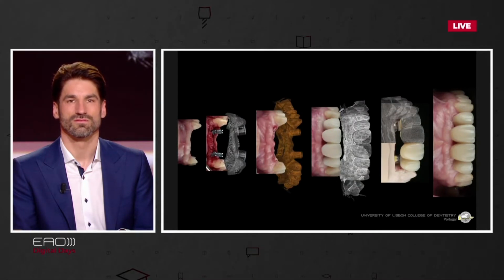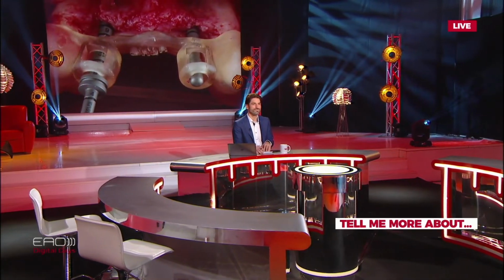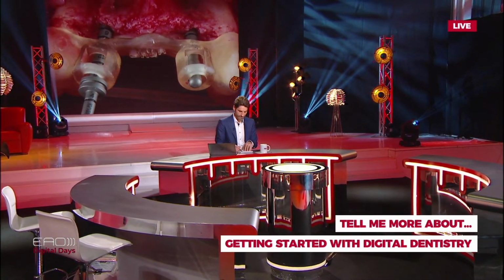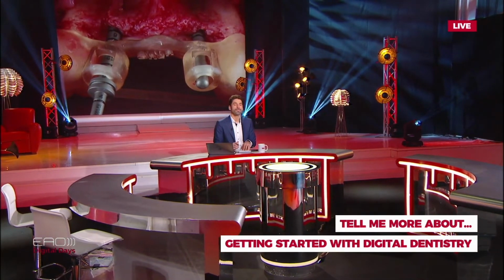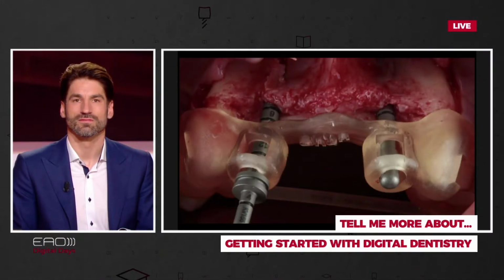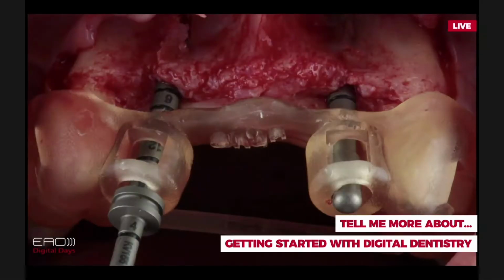So having said that, you also need to have clinically valid research in order to make all these recommendations to the general practitioner. But one of the key points for me, the most important, and one that we'll probably talk about in the next 20 minutes, is placing the implant accurately. Because when you're getting started with digital implantology, the first thing that you will be tempted to do within the implant dentistry scope is to have a digital guide or a surgical guide that will aid you to place the implant on the correct site.